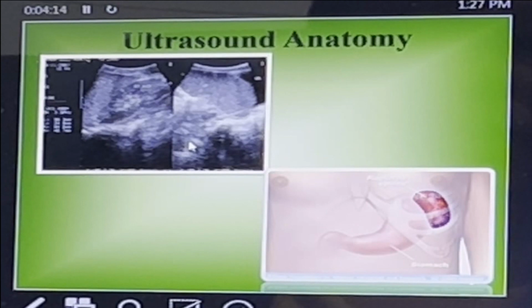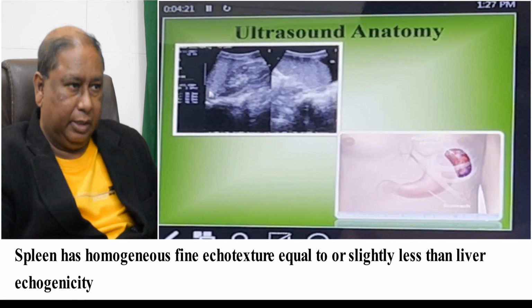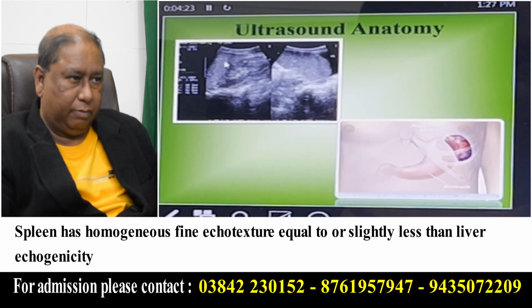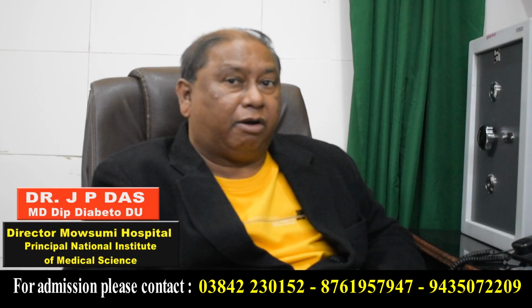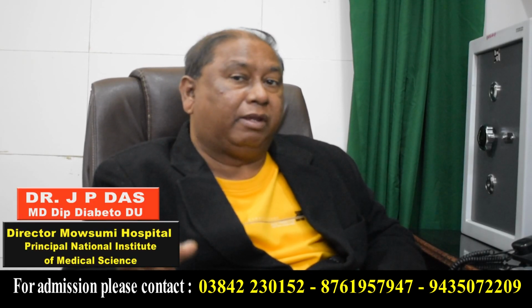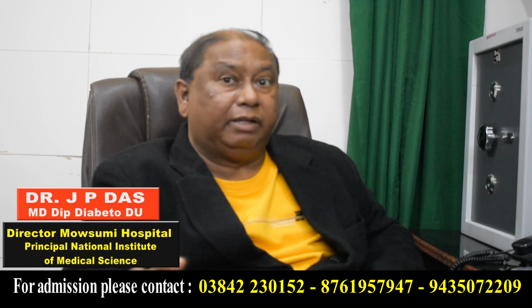Spleen has a homogeneous fine echostructure. This is spleen. See, homogeneous fine echostructure, and its echogenicity is equal or less than the liver.